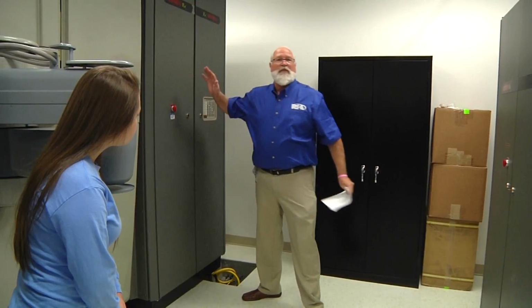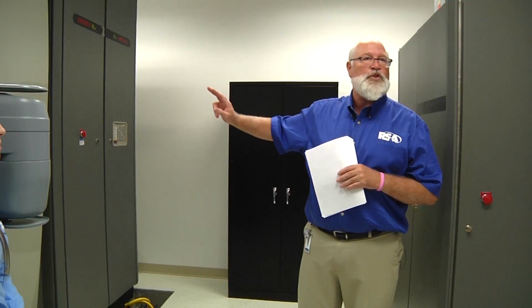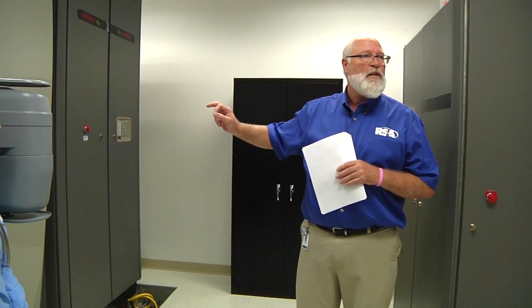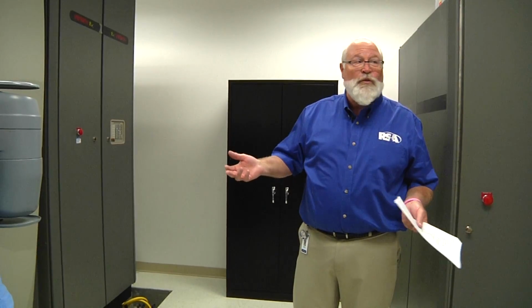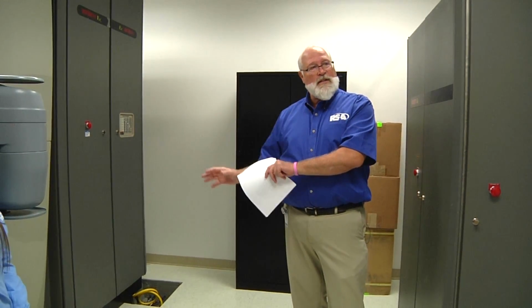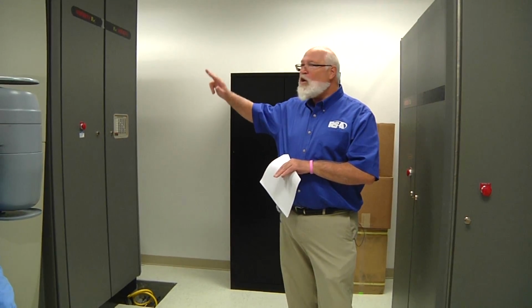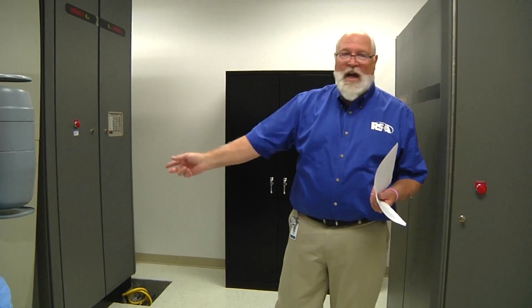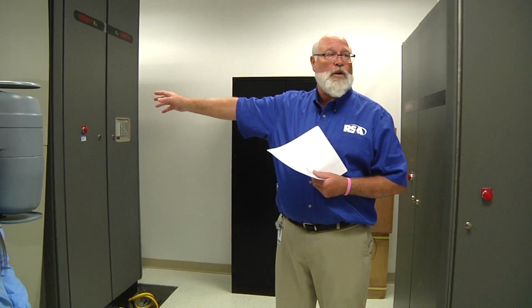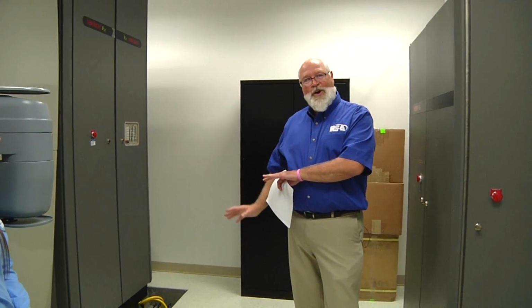We always joke that these are very good, inefficient water heaters. So we operate the machine at a constant 40 C, which is a really nice hot tub temperature of about 104 Fahrenheit. So we do that to cool areas of the machine, and we also heat areas of the machine. So everything's at a constant temperature. So you'll have water pipes all through the machine. Your guide has water pipes in it. Your Klystron has water pipes. Your target area has water pipes. There's water pipes in your bend magnet. So I'm mentioning a lot of water.